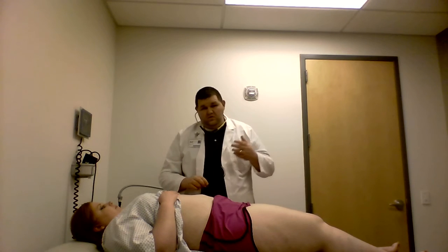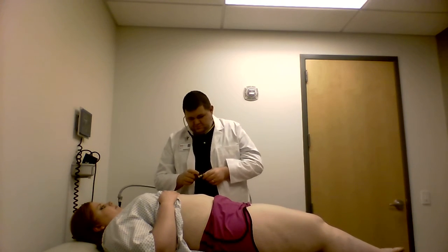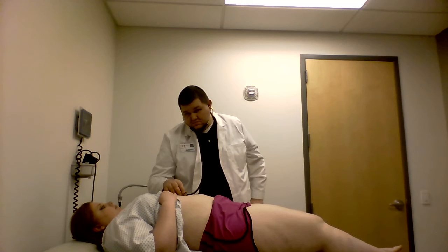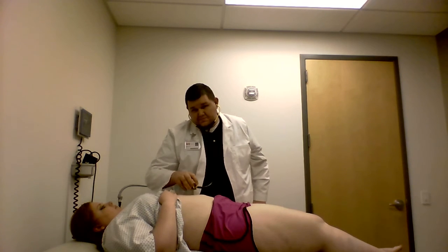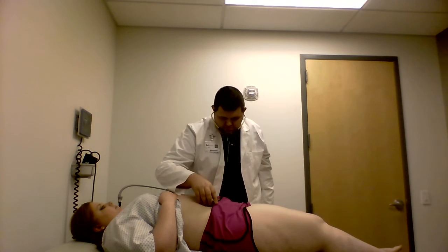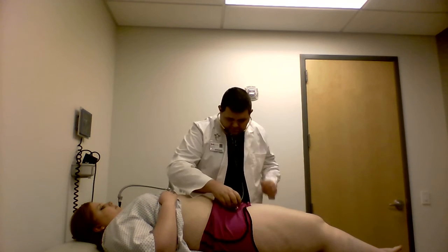Okay, I can hear normal bowel sounds throughout. Next, I'll listen for arteries. We'll start with the aorta. We'll be using the bell. Okay, we'll move to renal. We'll move to iliac. And then we'll move to femoral.